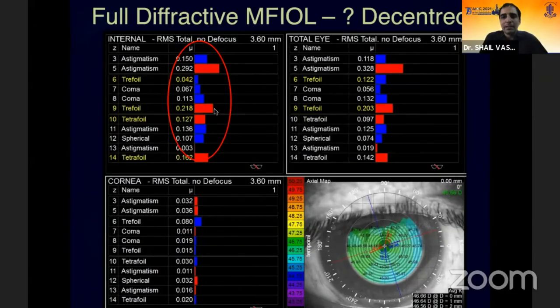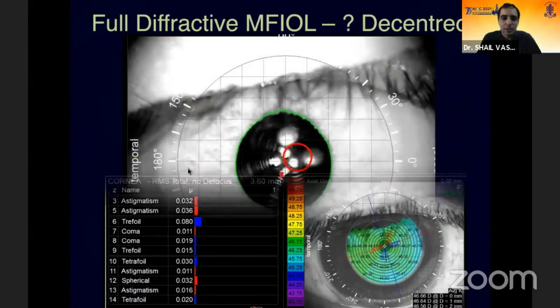It's a crystal clear posterior capsule. So if there is significant astigmatism, we can understand, but all of these were not adding up as to why this patient is having so many ocular or dysphotopic phenomenon when everything else seems to be good.